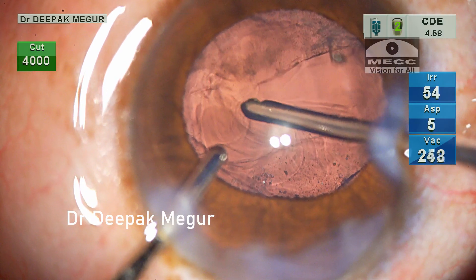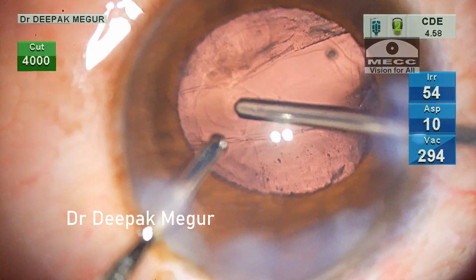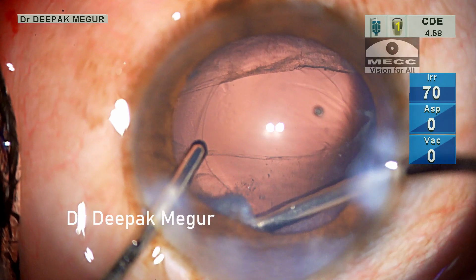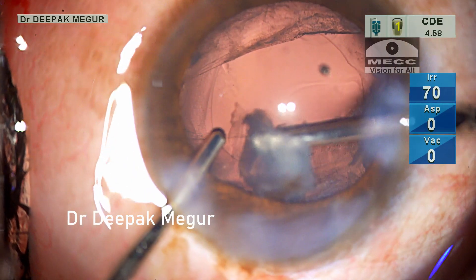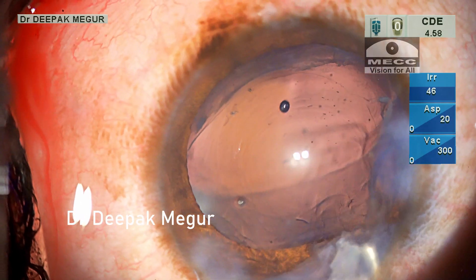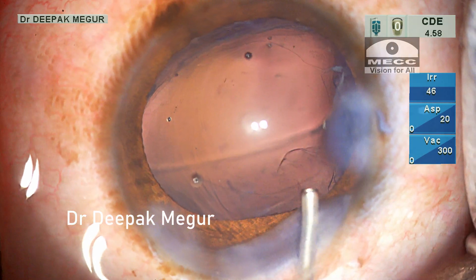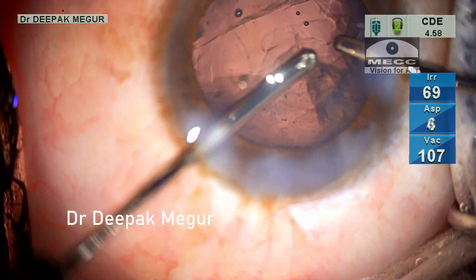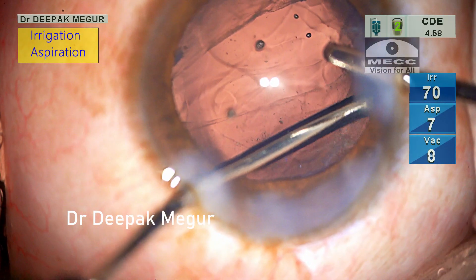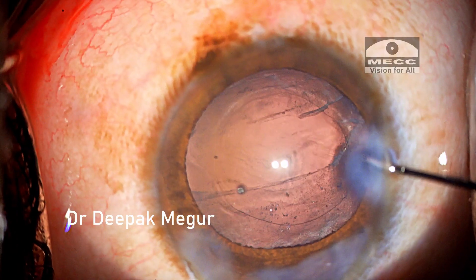I am back with my cutter. There is a small chunk of lens matter in the subcapsular region under the rhexis. It is gently manipulated into the anterior chamber and expressed out using OVD. There is still some amount of cortex remaining, which is aspirated out — this time using bimanual irrigation and aspiration. Now it looks clean.